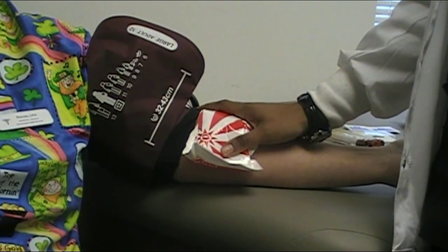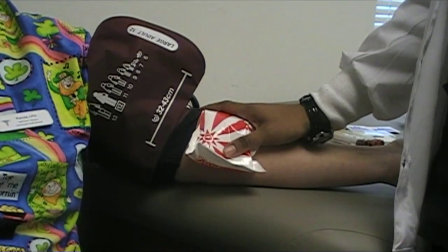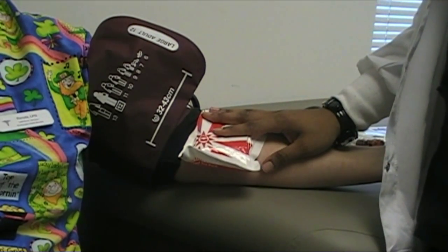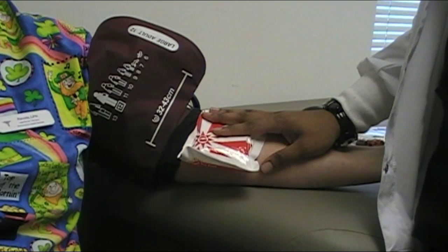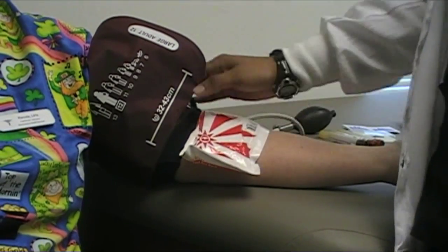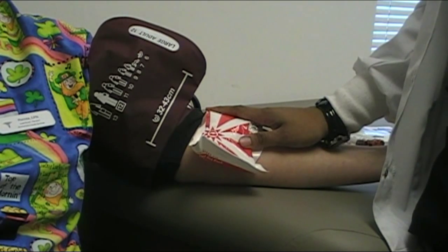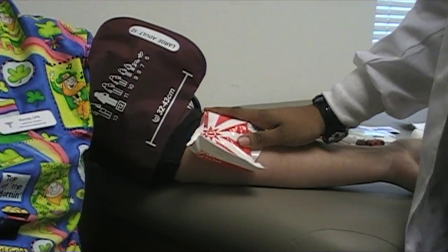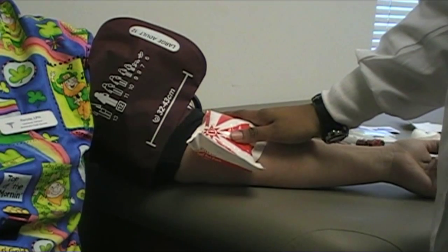Five minutes is going to feel like a lifetime. Do we need five minutes with you? Probably. The goal with this is that our tourniquet time, once we have that blood pressure cuff inflated, should be no more than a minute — a minute is maximum. The blood pressure cuff is acting as a tourniquet. The goal of a real tourniquet is to stop blood flow entirely. We're doing the opposite: we're using the same principle to fill that limb with blood and not let a bunch escape.